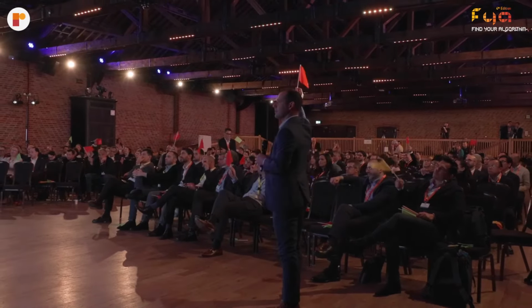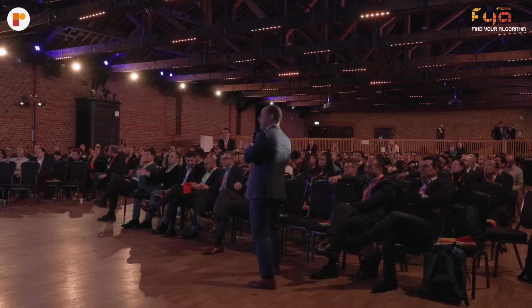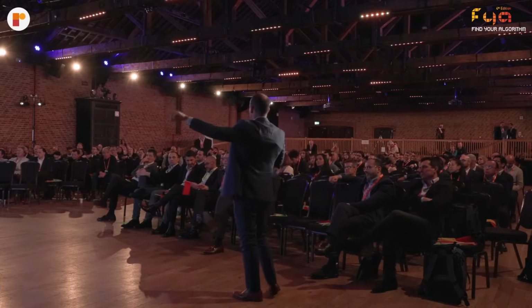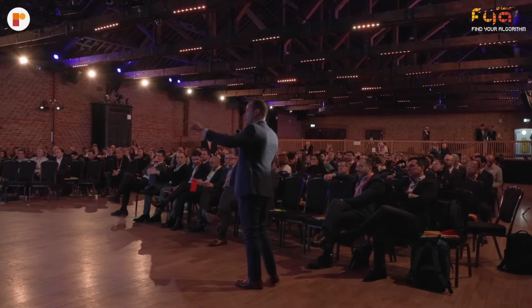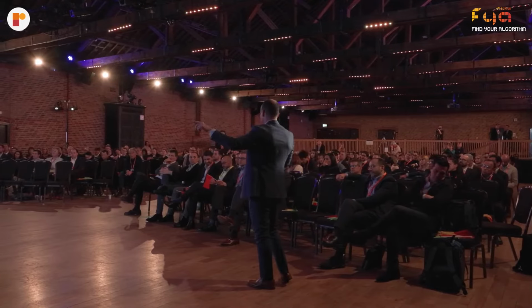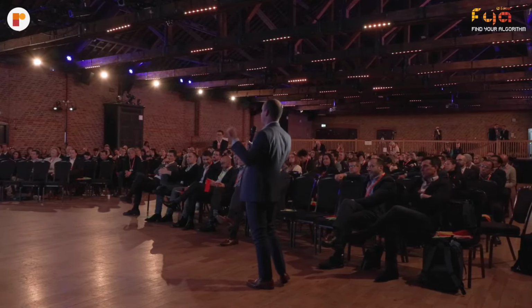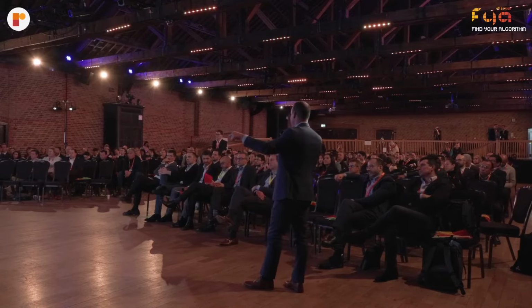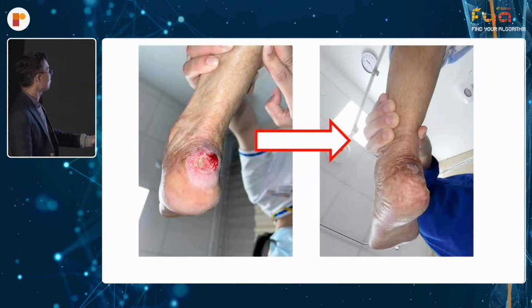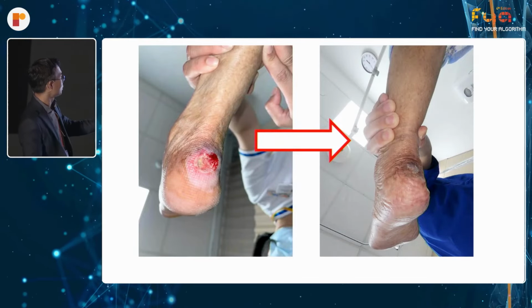I think most people are red, so this is what I did. You see, just as August said, he changed completely the projection. So if you want to navigate the foot arch properly, you go in anteroposterior view. Because it's a diseased foot arch, it's not a great foot arch. If you don't go in anteroposterior, you will lose time going to the metatarsal arteries, you will end up dissecting it, and if you dissect, then you will cry, I think. Okay, and this is the end result. And this is the heel ulcer, I think it was 2 months afterwards.